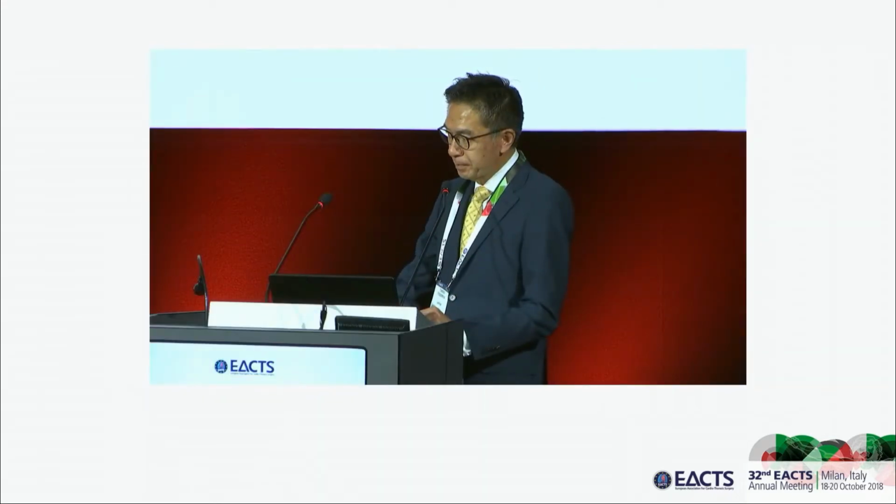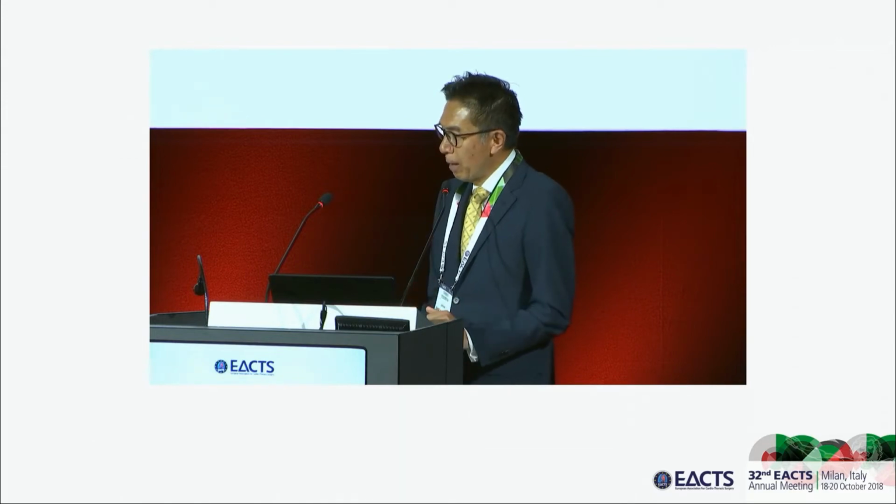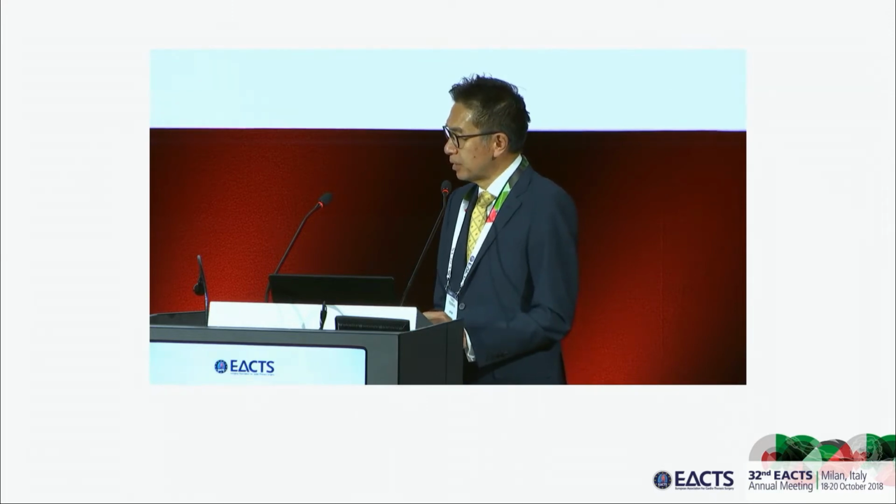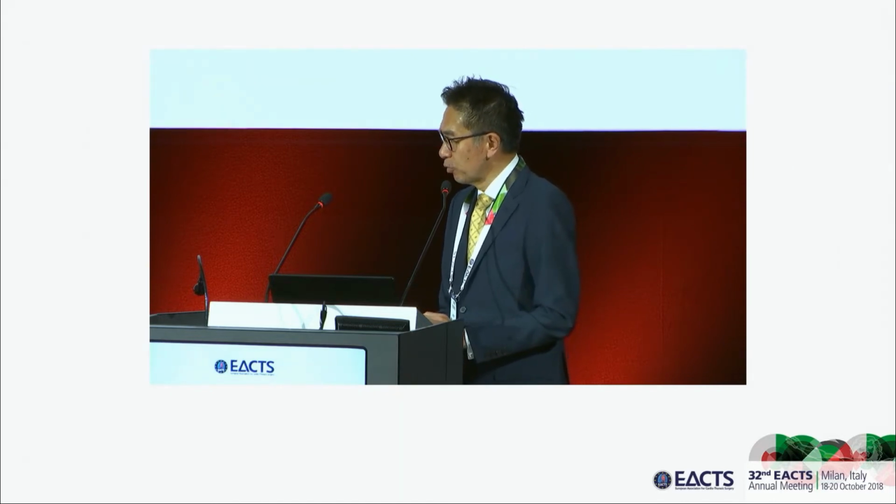Yeah, this series is a very limited patient group, I told you. But if a patient has a very dilated STJ greater than 30 millimeter, it is not good for this kind of operation. And also, we have no good vessel on the STJ ring, the artificial ring. So AAE patients are a contraindication for this kind of procedure. Right.